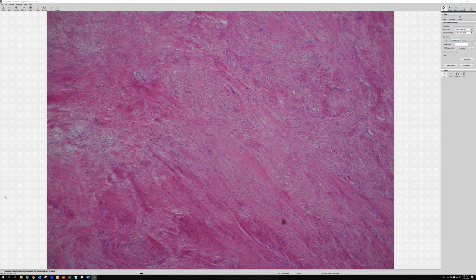That's the key. And then you can use an immunostain, MUC4. MUC4 is going to be positive in this tumor. And it can stain a few other things, but overall, when it looks like this, it's a very specific marker in the proper histologic context.